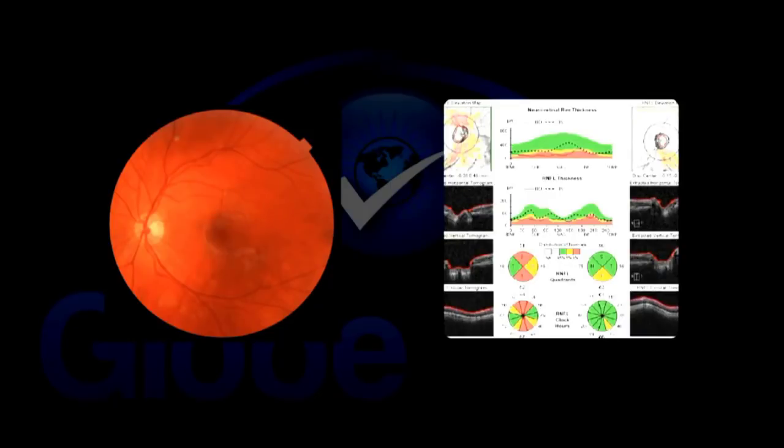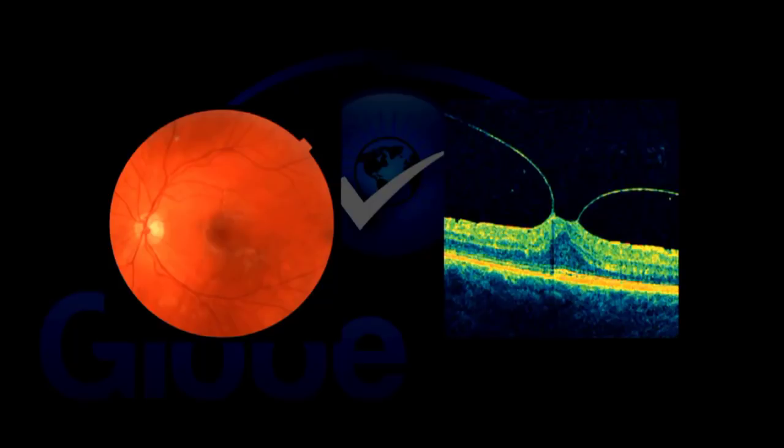So we've got a normal fundus photograph here. We've got an OCT that shows obvious optic nerve disease that's not picked up by the fundus photo. Another patient has a normal looking macula, but obvious vitreomacular traction. Before we do cataract surgery in our practice, we do an OCT on every single patient. We want to know what's going on in the back of the eye. And I can't count the number of times that I do an OCT, I swear the macula looks completely normal, and they've got this problem right here.